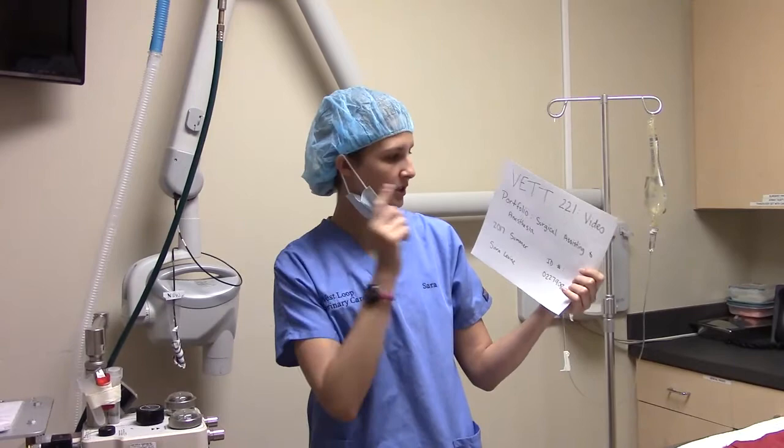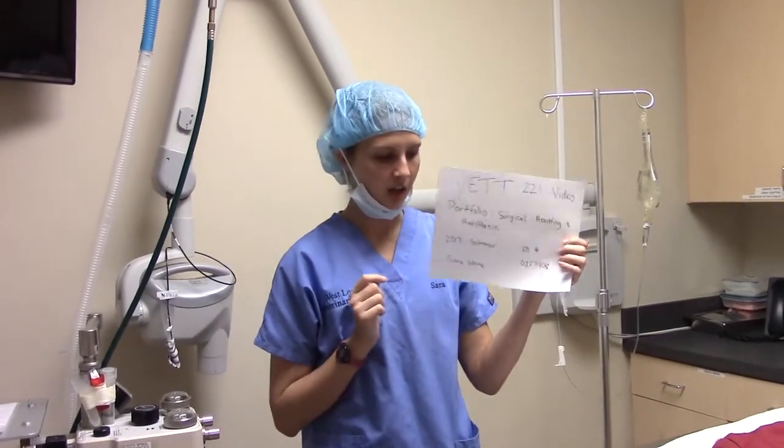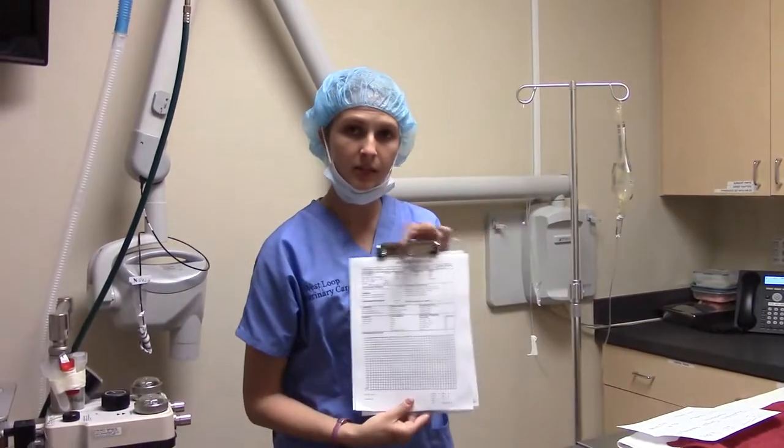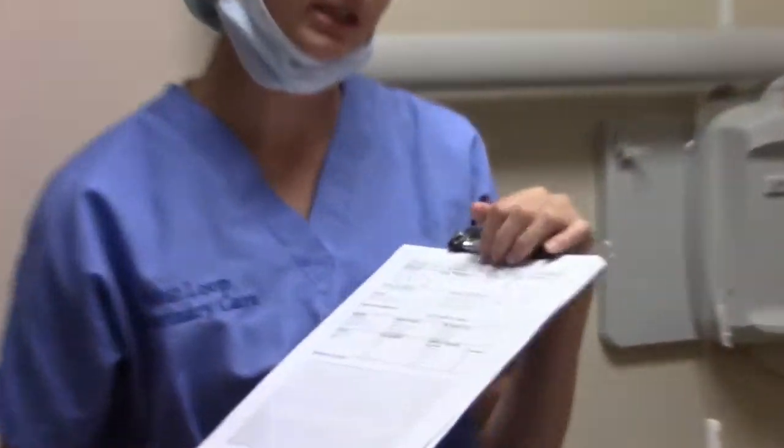Hi, my name is Sarah Levine and this is for VET 221, the video portfolio, surgical assisting and anesthesia. Today we are going to be doing a procedure on a nine-year-old spayed Yorkshire Terrier. We're going to be doing a dental assessment and treatment.